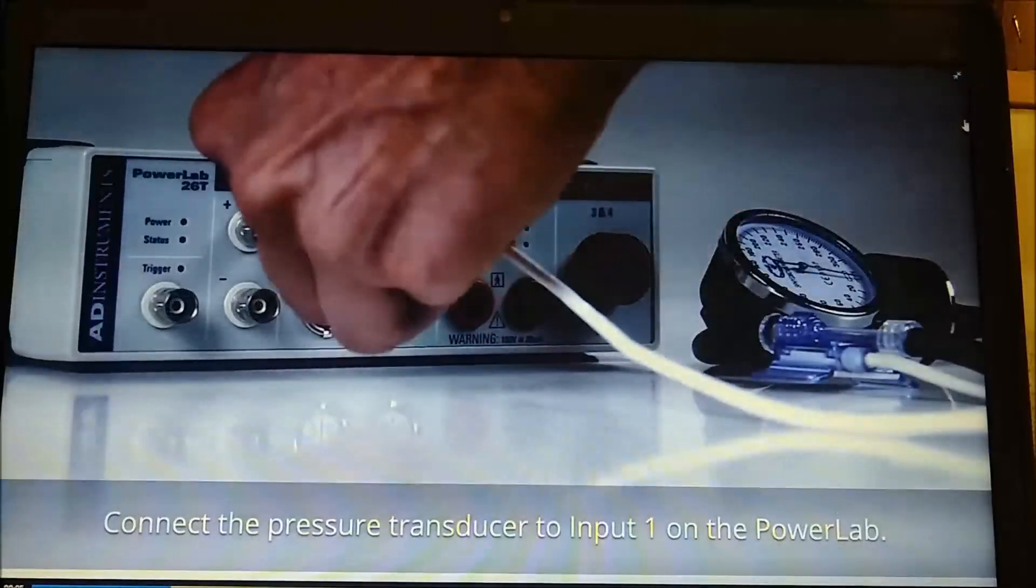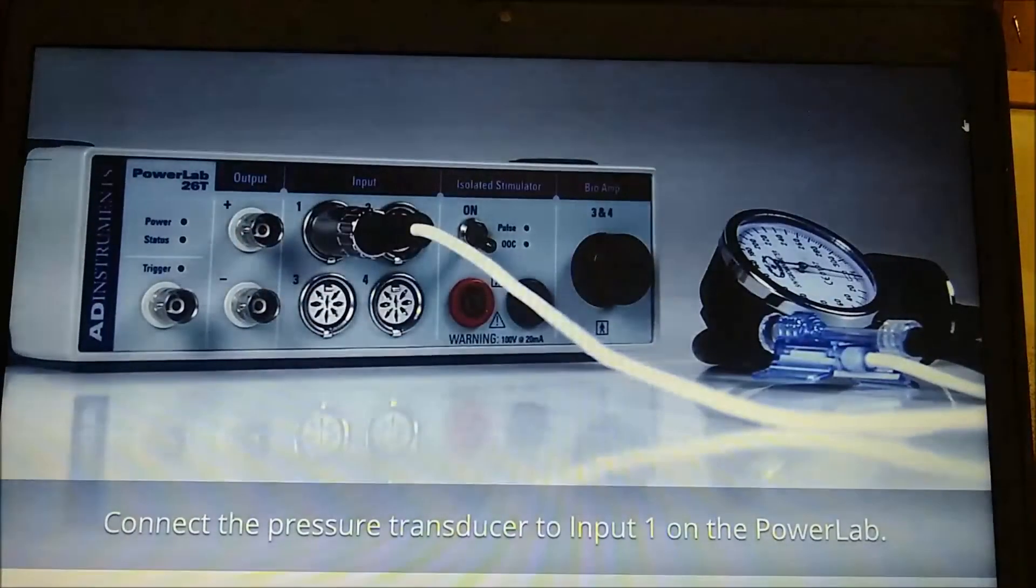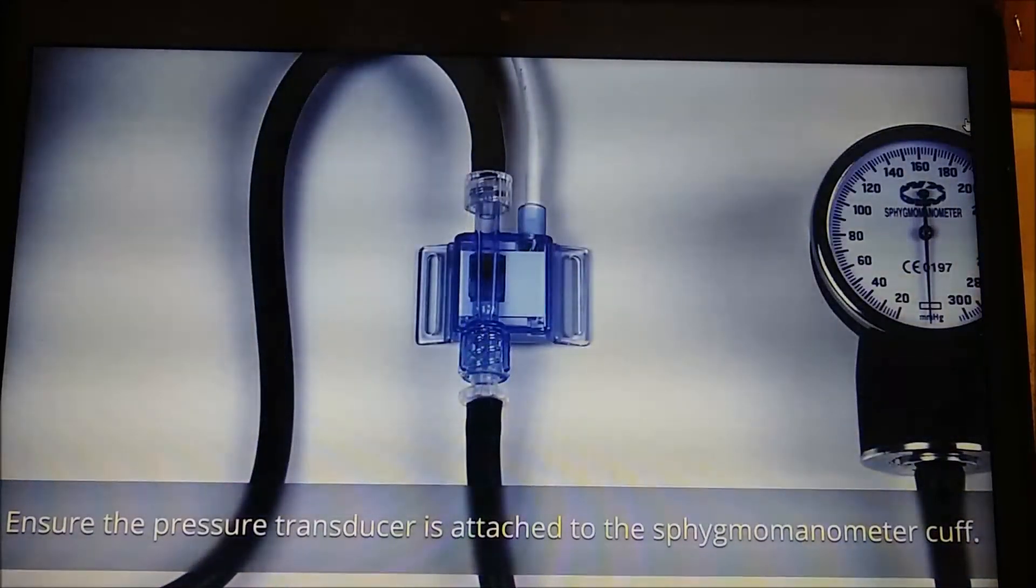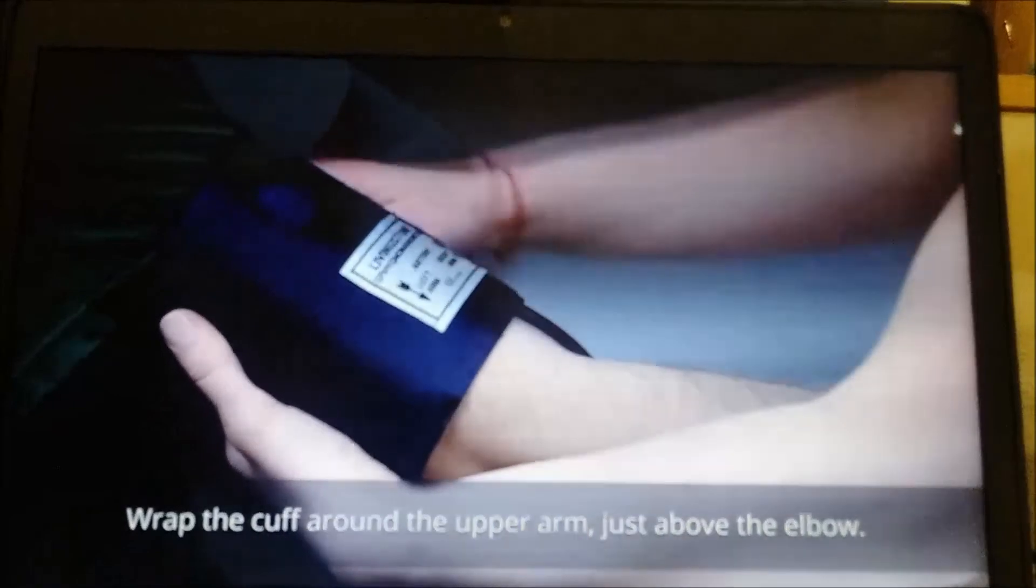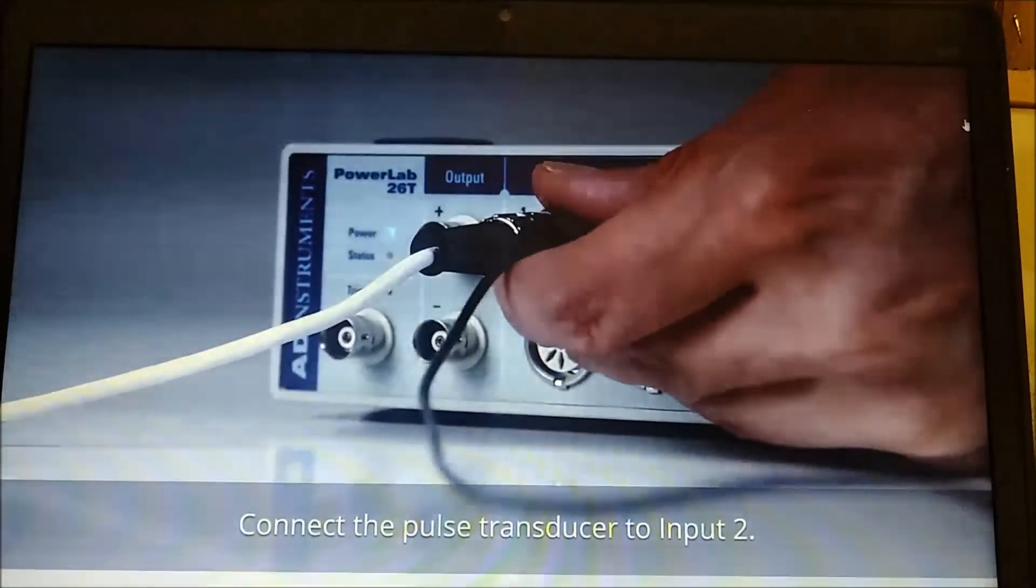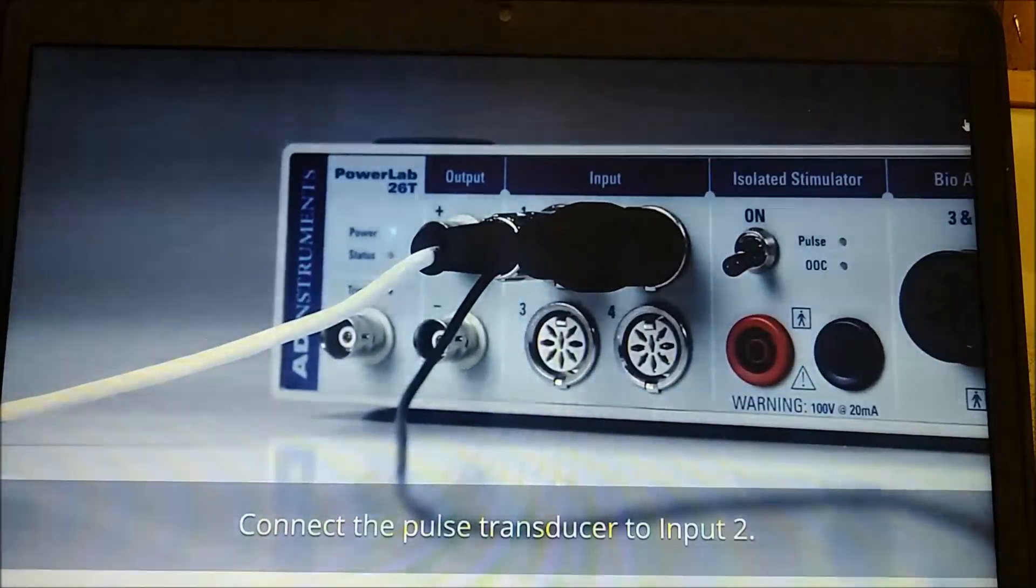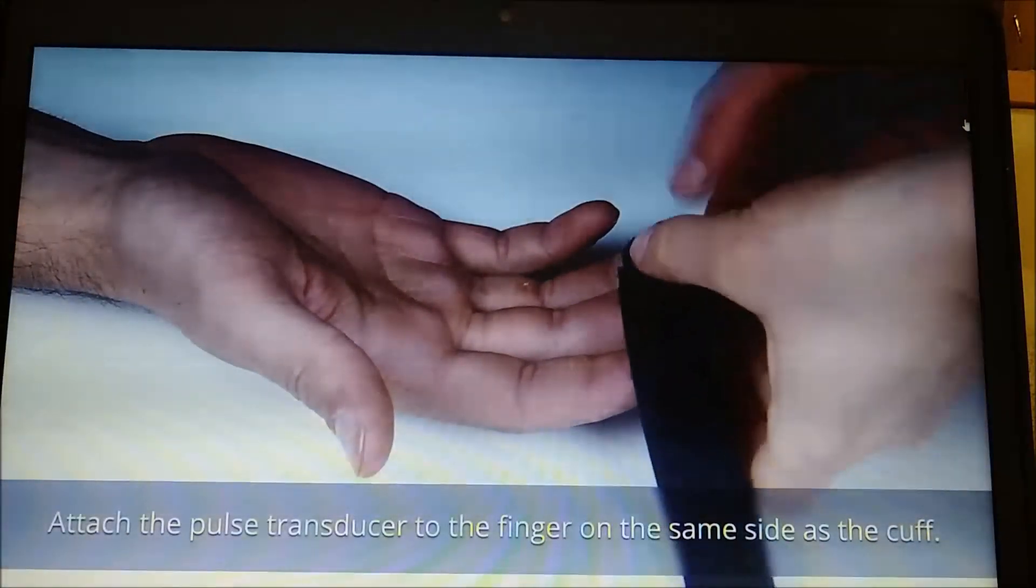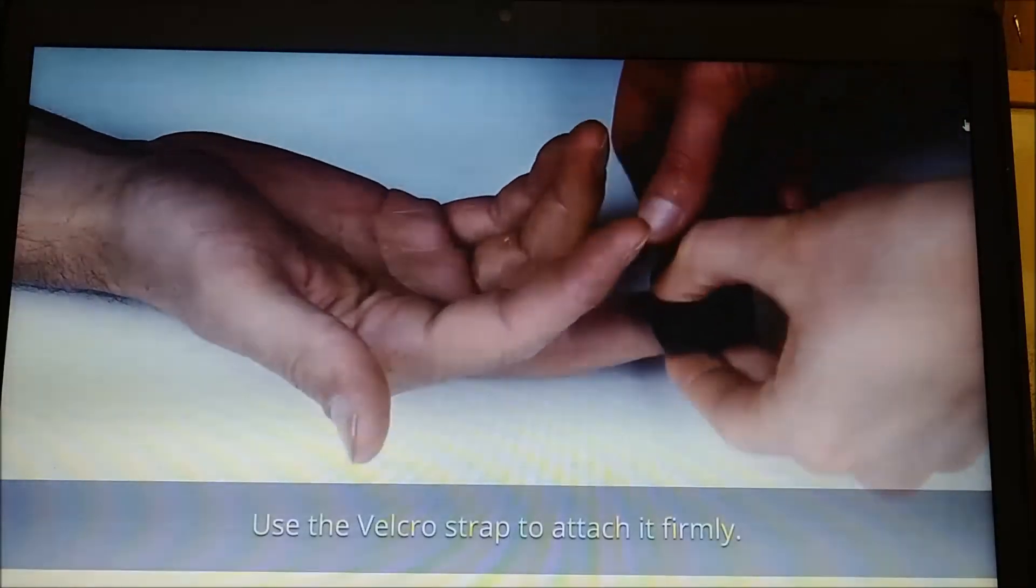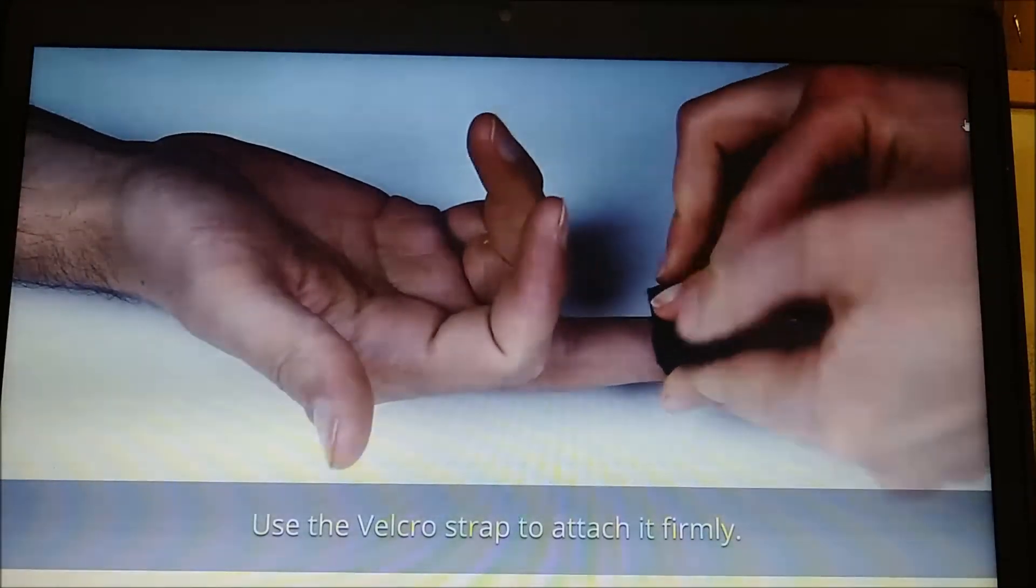Connect the pressure transducer to input 1 on the PowerLab. Ensure the pressure transducer is attached to the sphygmomanometer cuff. Wrap the cuff around the arm just above the elbow. Connect the pulse transducer to input 2. Attach the pulse transducer to the finger on the same side as the cuff. Use the Velcro strap to attach it firmly.